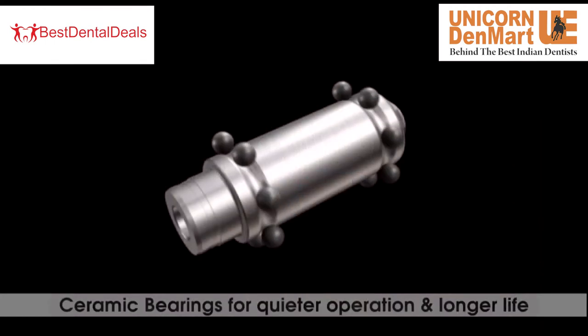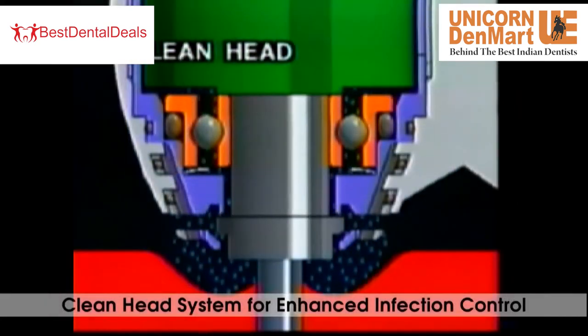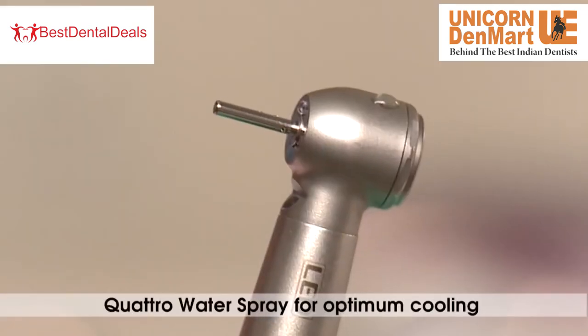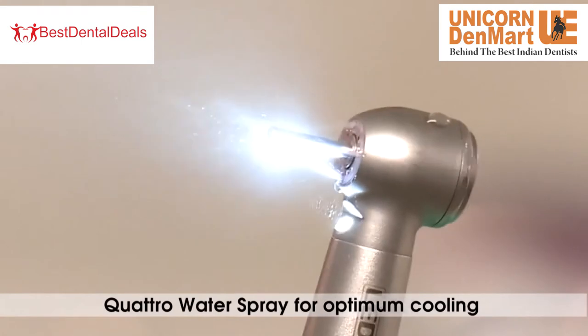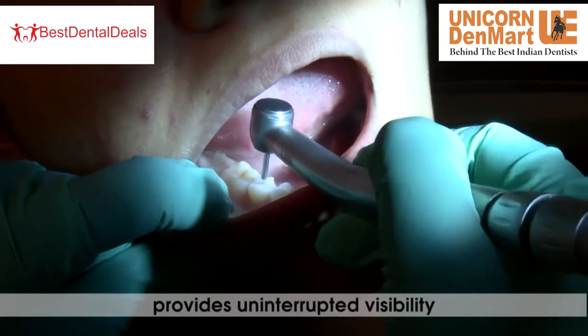Ceramic bearings provide quieter operation and longer life. It has a clean head system for enhanced infection control, preventing cross contamination. Quattro water spray also provides uninterrupted visibility and optimum cooling.